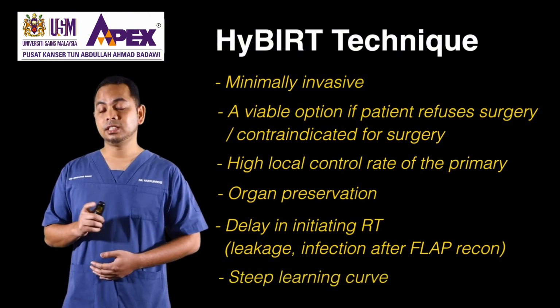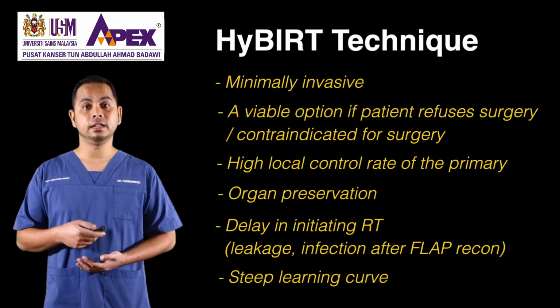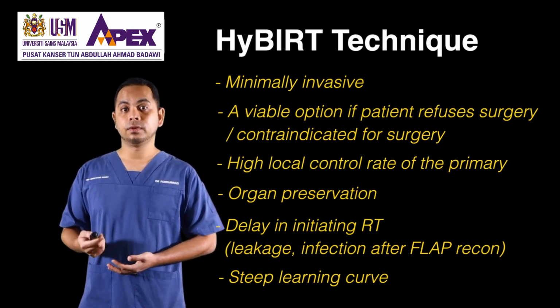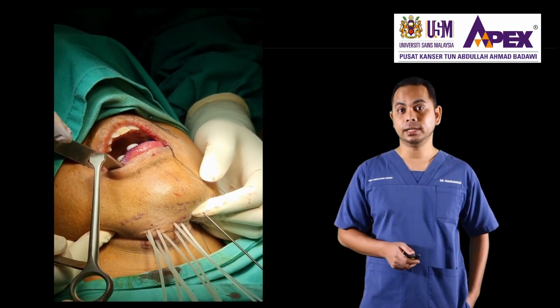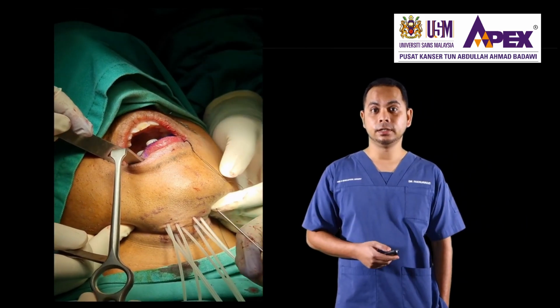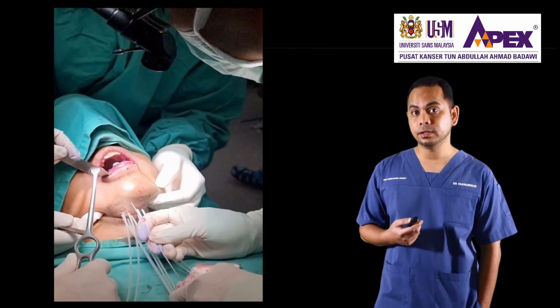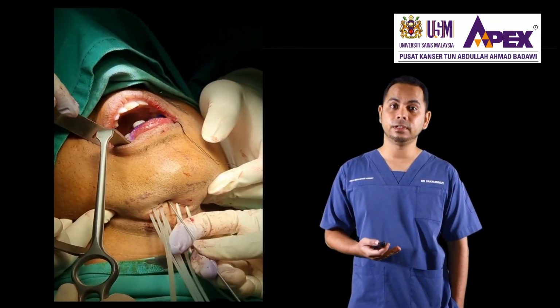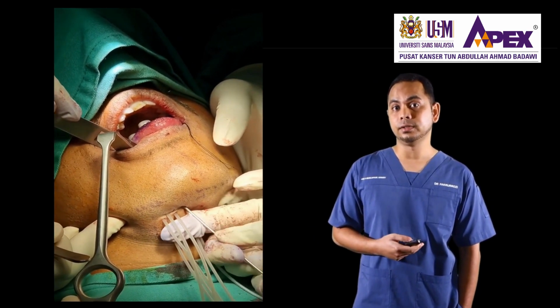Definitely it is a steep learning curve. There are many things that I think we can personally improve and research in order to improve our treatment success. This is how we insert the applicator inside the mouth during the procedure. As you can see, it is quite difficult for us to visualize the tumor margin if it is at the posterior one-third of the tongue.